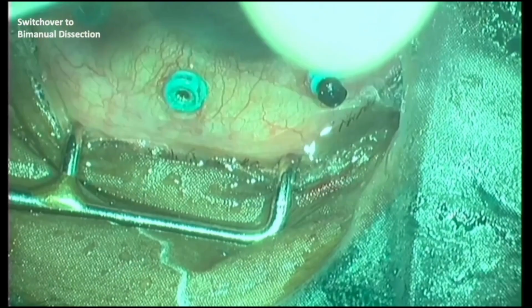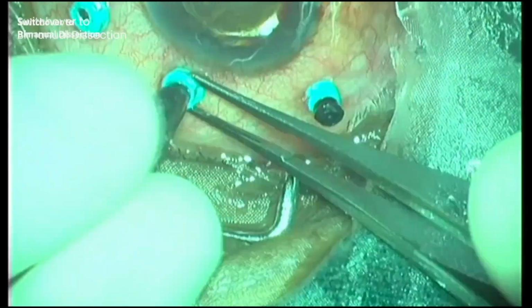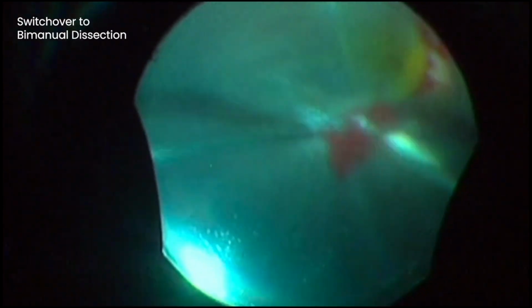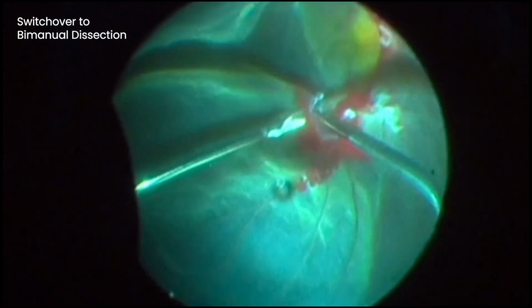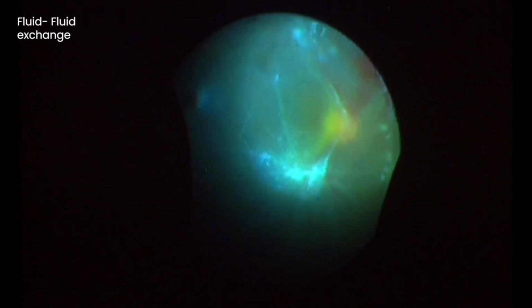A superior proliferation, however, if firmly adhering, is one wherein a chandelier-assisted dissection had to be used. Bleeders during bimanual dissection can turn out to be messy. A high degree of anticipation of bleed helps in preventing and tackling the same. A fluid-fluid exchange decreases the turbidity of the subretinal fluid for faster settling of the detached retina.